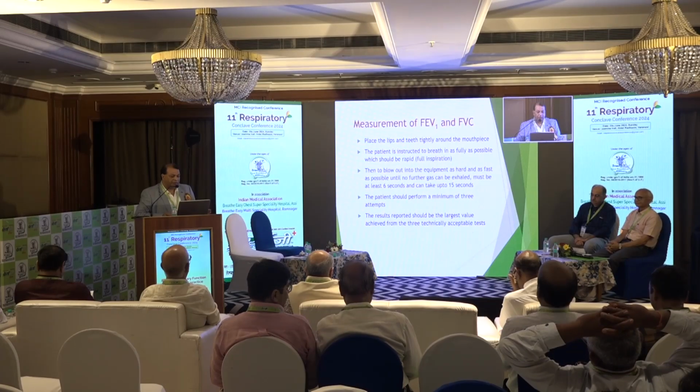The patient should be instructed to breathe in as fully as possible, then to blow out into the equipment as hard and as fast as possible until the lungs are empty. The exhalation must be at least 6 seconds. The patient should perform a minimum of 3 attempts. The result reported should be the largest value achieved from the 3 technically acceptable tests. The difference between the values should be less than 5% or 100 ml.